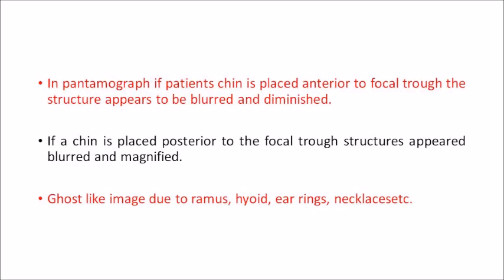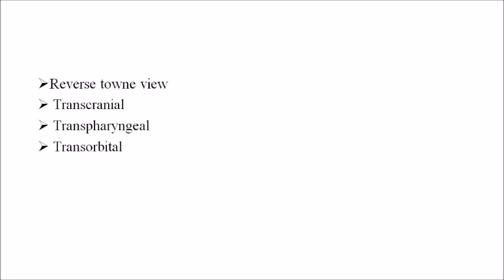Coming to the TMJ views, the most important are three views: the transcranial view, the transpharyngeal view, and the transorbital view.